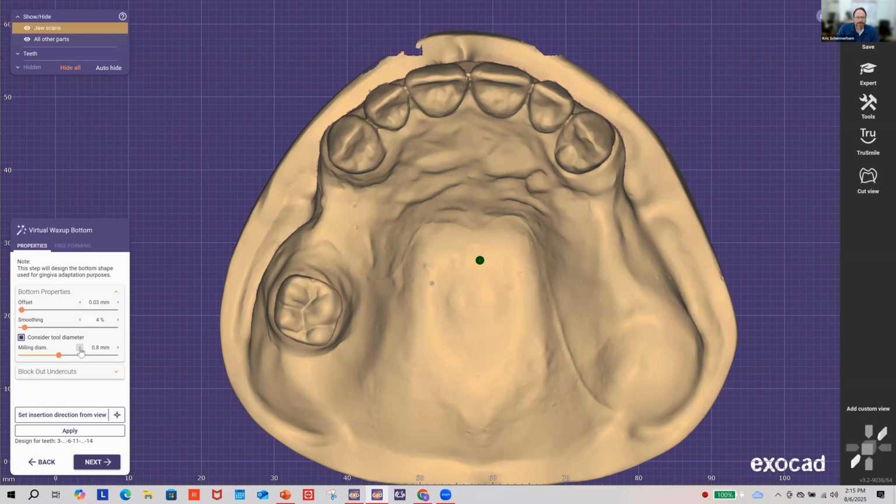And just to give you guys some insight, I have a VHF milling machine that's the S2, which is like the S5, but an older version. I've had it 7 years and it's still cranking and doing great. I have a 52 DC that I've had for 4 years. And then I have a 53 DC, which I've had for 2 years, something like that. And this setting seems to give me consistent results with each one of those milling machines.